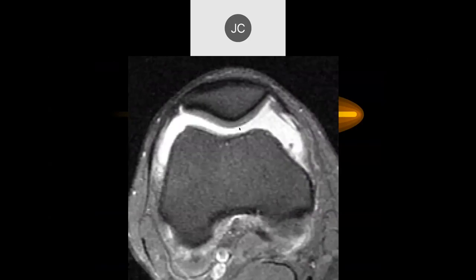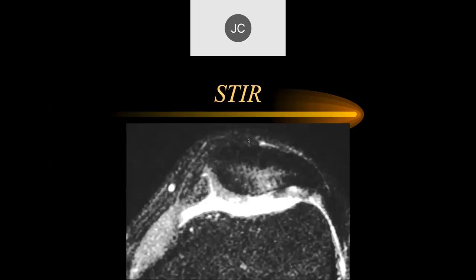If we go to a lower TE, more of a proton intensity, fat suppressed sequence, we can get something like this. But again, with fat suppression, you do lose signal to noise. Here's another PD technique a year or two later where we have better signal intensity. You can also use stir imaging, where you can get fairly good contrast. But typically with stir imaging, we don't really see the details of the articular cartilage as well, but you can often get very good contrast between the water and the other structures. Here we can see a full thickness grade four defect with underlying bone marrow edema.